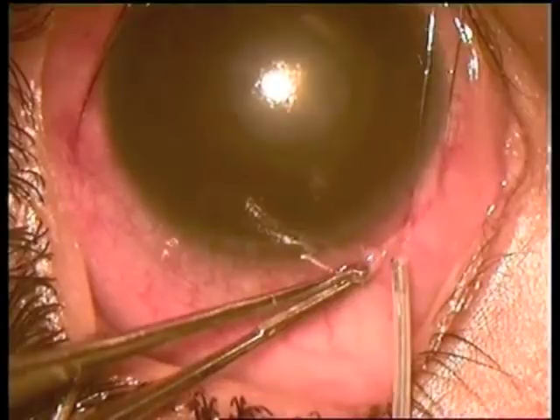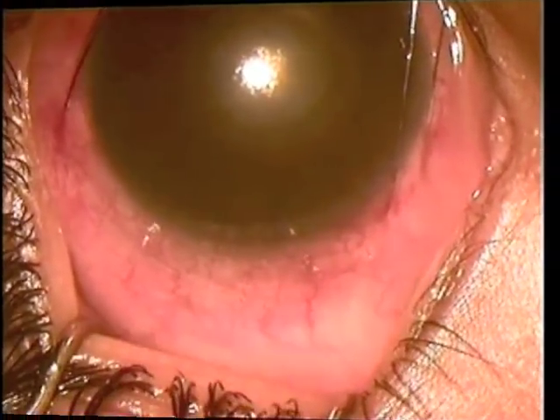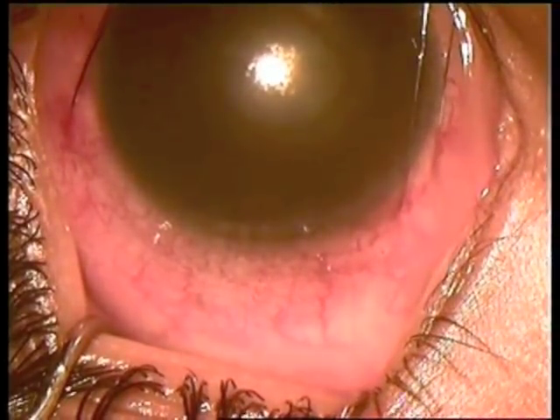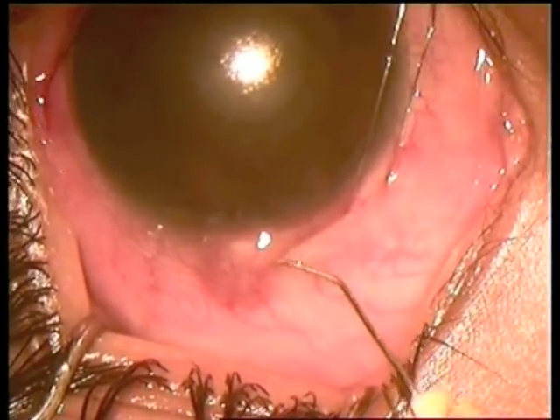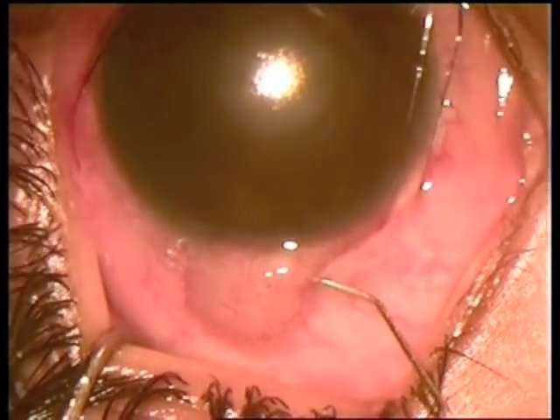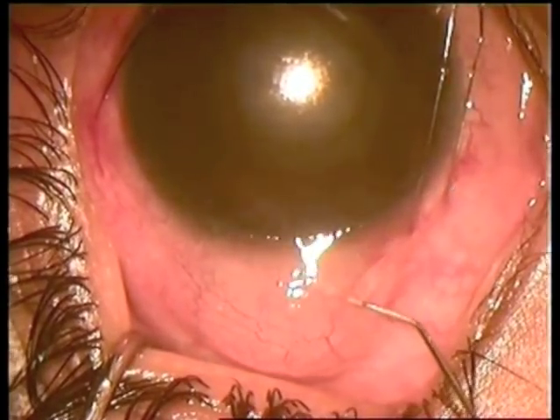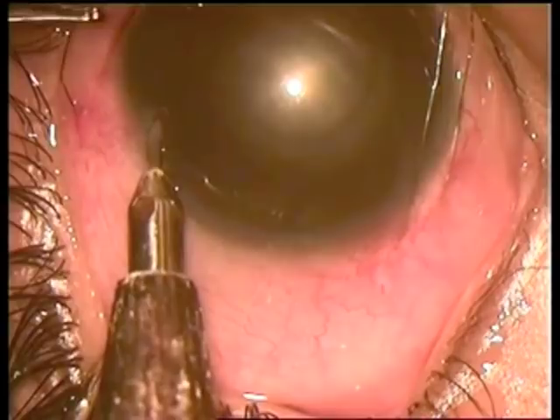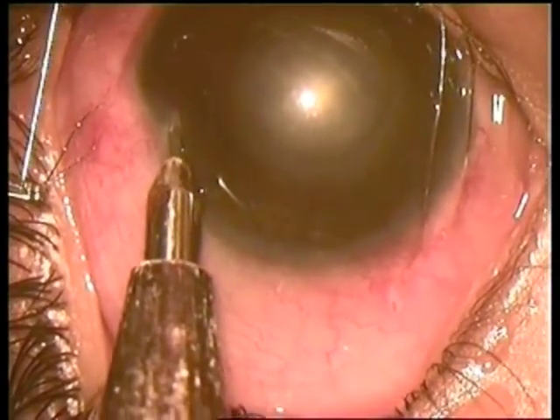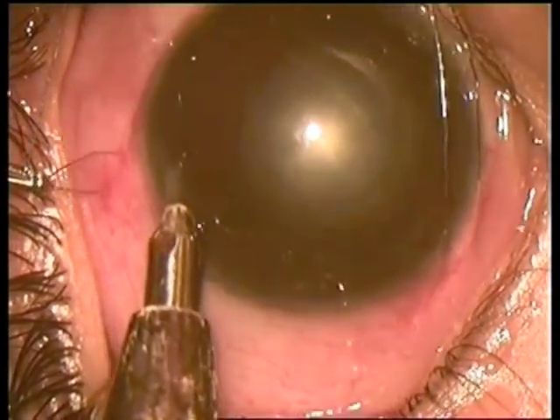The eyeball is pushed down. A hole is made in the conjunctiva and 0.02% Mitomycin is injected. Then a pocket section is made at 3 o'clock.